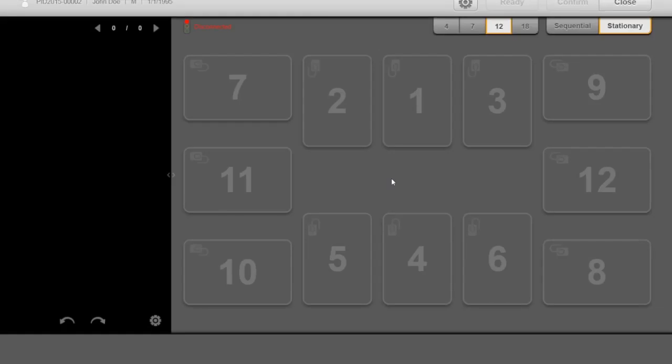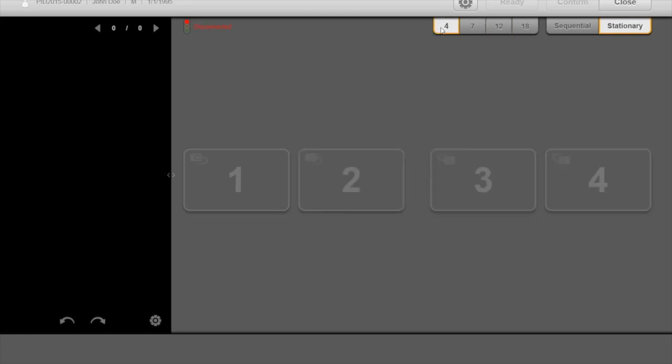After checking the patient's information, you will see the main window of RIOView. The desktop is where images are displayed when they are being viewed or captured from an external source. This is the sensor indicator. It provides the connecting information of the sensor at all times. This is your teeth selection tab.